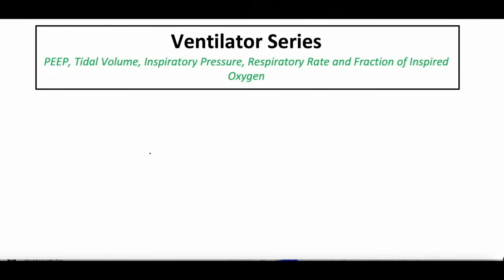Introductory settings on the ventilator. Some of this is ventilator mode dependent, but let's just start with, let's just say you have a patient, stick figure person number 1, who unfortunately has a really bad pneumonia, so they end up on a ventilator. What that means is they have an endotracheal tube, right? It goes into their mouth, down into their trachea, and hopefully sits right in the trachea above the carina.